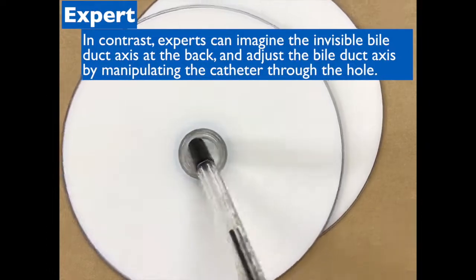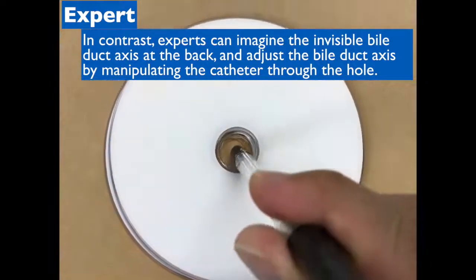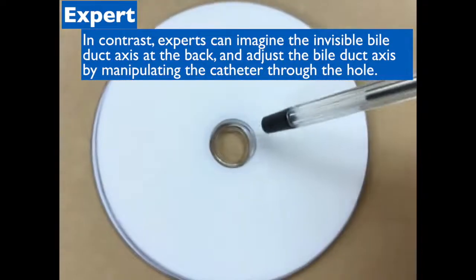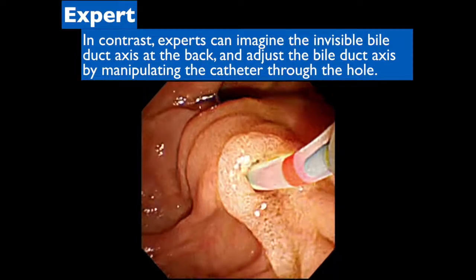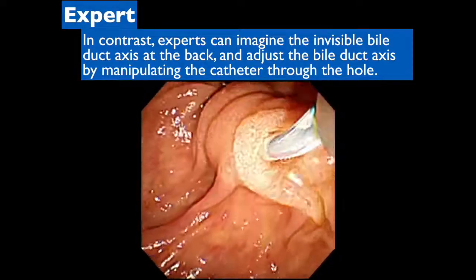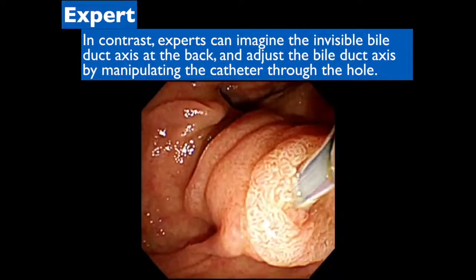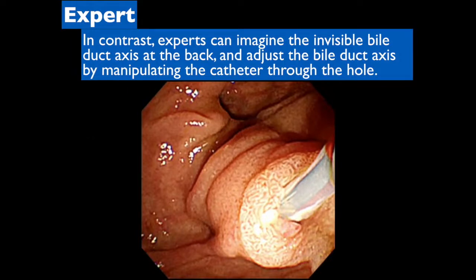In contrast, experts can imagine the invisible bile duct axis at the back and adjust the bile duct axis by manipulating the catheter through the hole. The CD method can be summarized using the following schema.